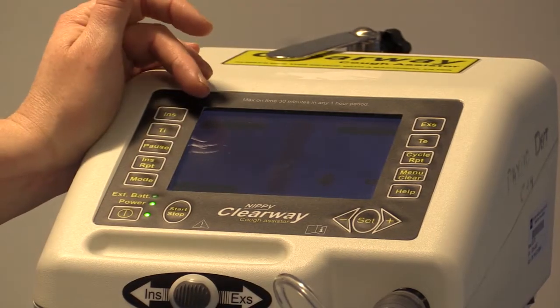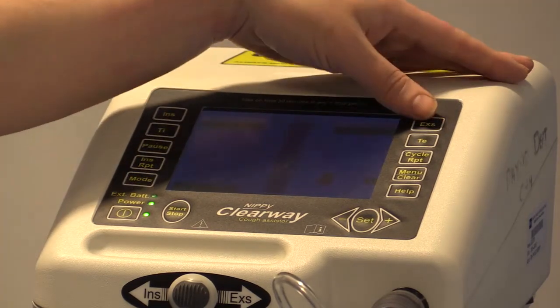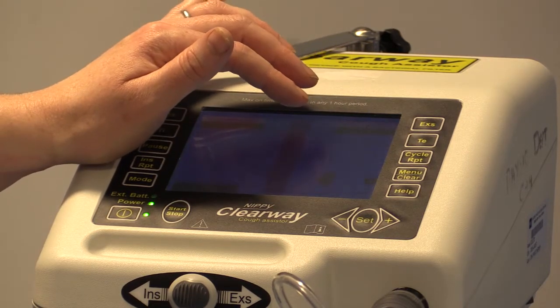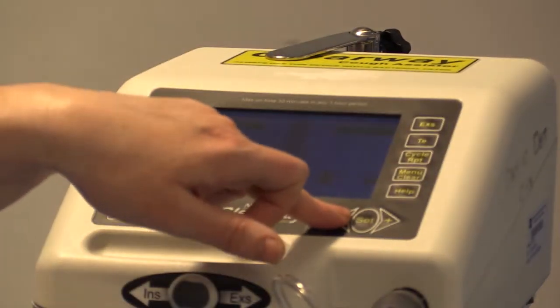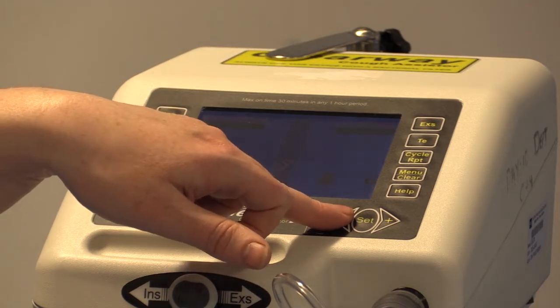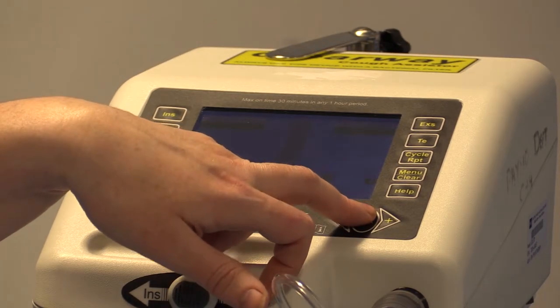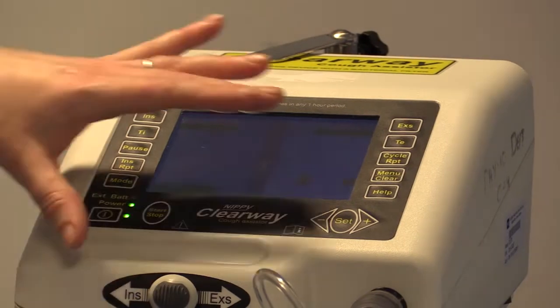If you press the positive button on the bottom right-hand side it makes it more positive; if you press the negative button it makes it more negative. I've set insufflation at 20 centimeters of water — press the set button and the flashing light will turn off. To set your exhalation pressure, press the exhalation button on the top right-hand corner. A pink flashing indicator will appear around exhalation to allow you to change the value. Pressing negative makes it more negative — so from minus 25 it goes to minus 26, minus 27. Pressing positive makes it less negative. Once you have the levels you want, press set and the flashing light will turn off.